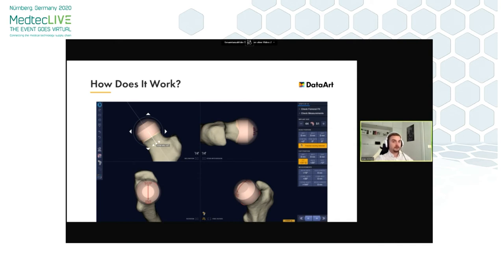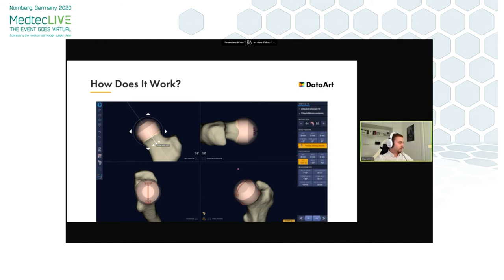There are plenty of information messages intended to guide and warn the user if anything is potentially wrong. For example, we see the message that bone notching is present in this case. In addition, a user can see where it is located, as it is marked red on the model in the lower two windows — in these areas around here.